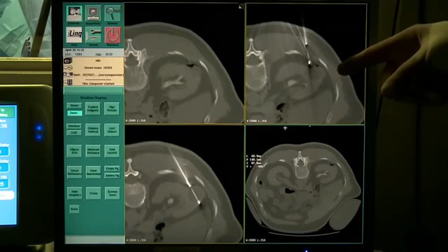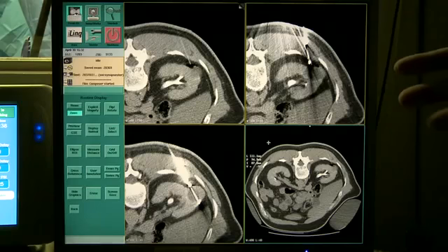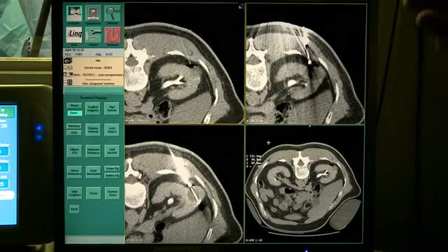Go to the other window, Michelle, the abdomen window, and you can see the tumor. Again, as we get more and more probes in, you get more and more metal artifact. The utility of apnea and the absence of motion becomes more and more apparent. I really recommend, if you can get GA for these cases, that you use them.